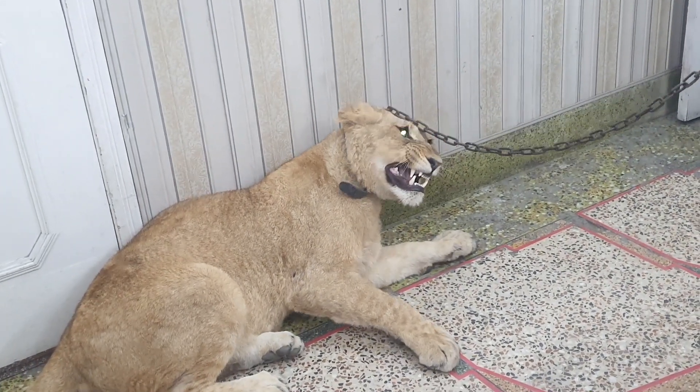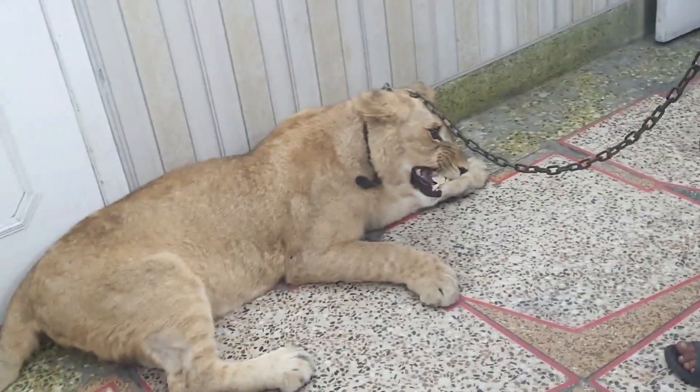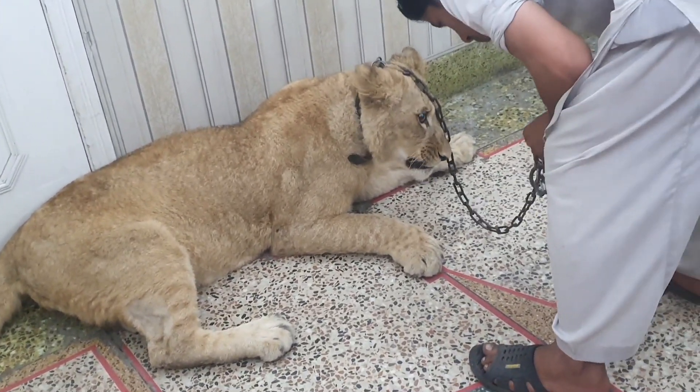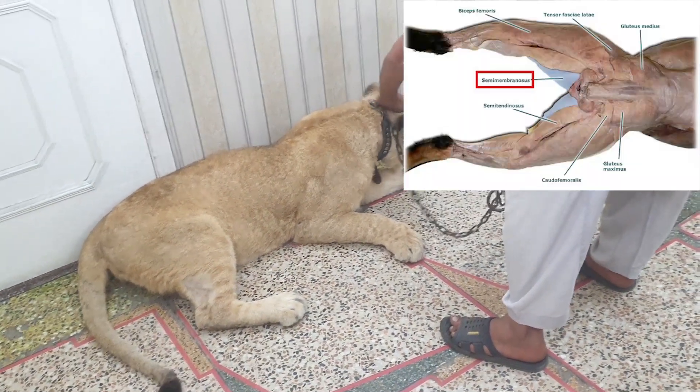Hello and welcome to my YouTube channel. Today we are going to see how to administer the intramuscular injection in felines. First of all, we have to restrain the animal so we can administer the injection easily.